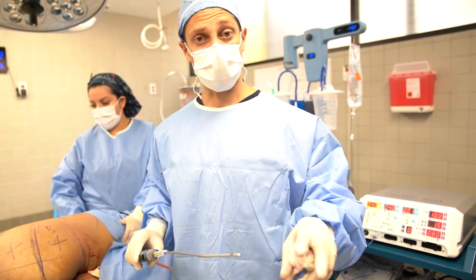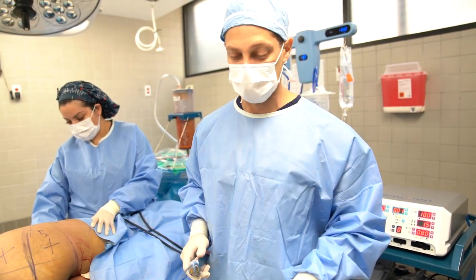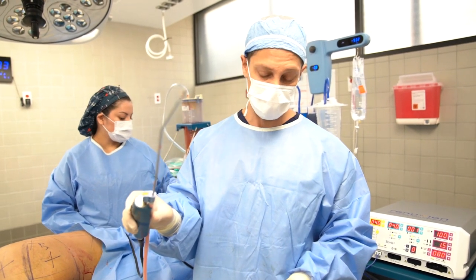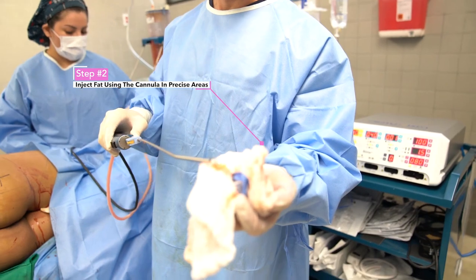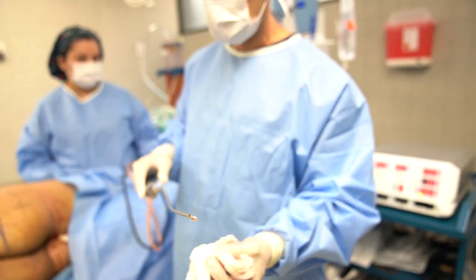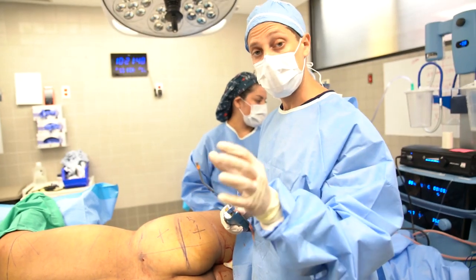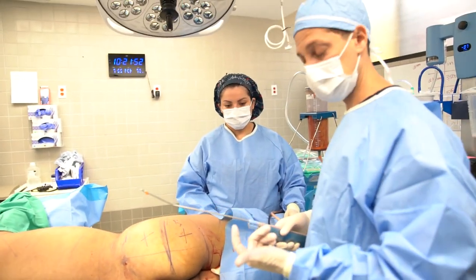We've finished performing liposuction. The next step is to inject fat. There are different methods for injecting fat — I use EBL, Expansion Vibrational Lipo Filling. It simply means we use this device, the same cannula, and inject fat. You'll see fat coming out of the cannula while it's moving. What this allows us to do is break up any areas of resistance while placing fat exactly where we want it. I do think it's a safer technique.